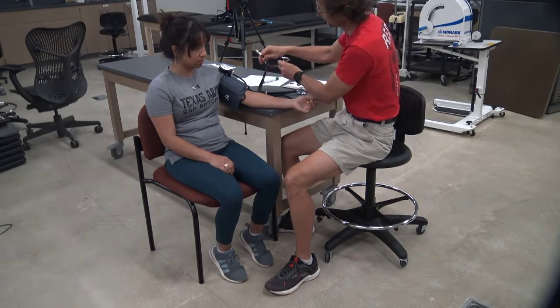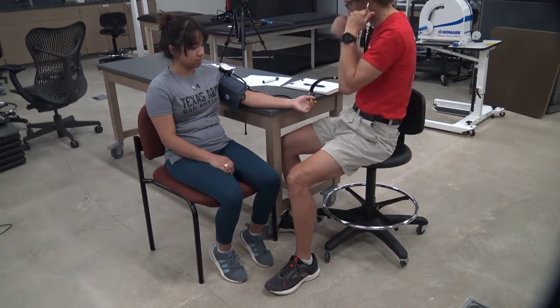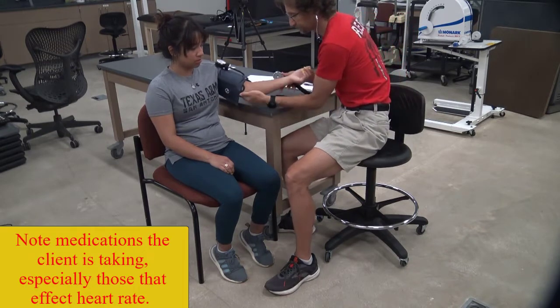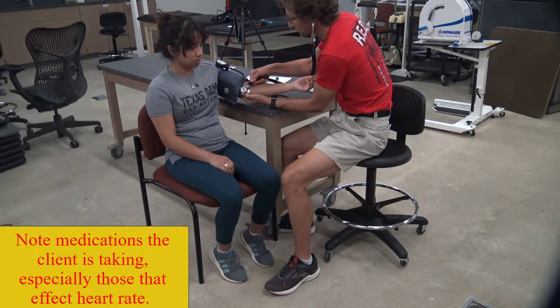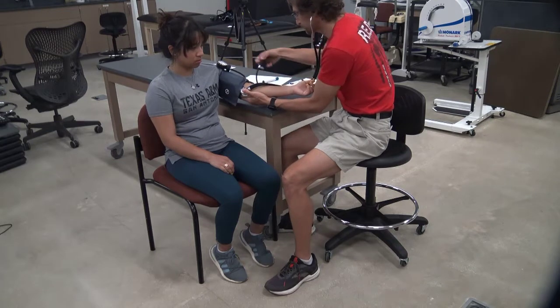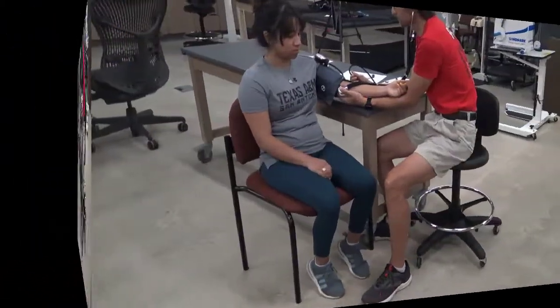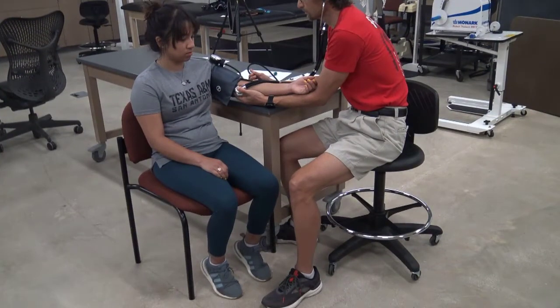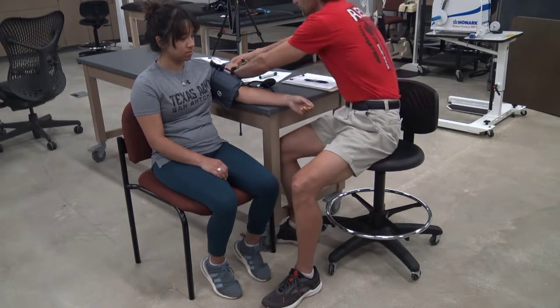Prior to performing the single-stage protocol, and as prior to any exercise, be sure your patient is medically cleared to perform the test. Have the patient sit quietly for about five minutes and take heart rate and blood pressure readings. Be sure to view the heart rate tutorial and the blood pressure tutorial for specific instructions on how to measure these. If your client is severely deconditioned or has other medical issues that would prevent them from starting on the first standard stage, you can use the modified Bruce to start them at a lower MET level.